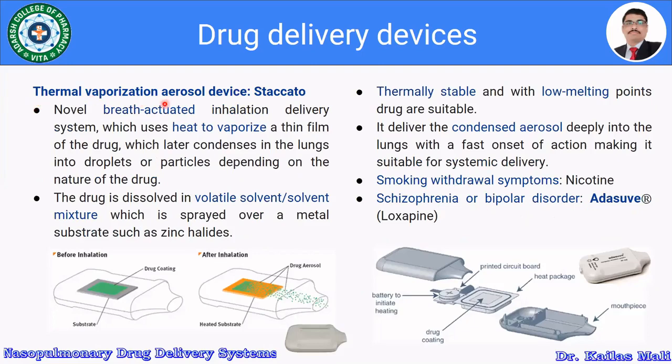Let us see the thermal vaporization aerosol device, that is Staccato. This is the Staccato device, which comprises a plate coated with the drug solution. This is before inhalation, and this plate is going to be heated, which is going to aerosolize the drug, and furthermore it is going to be inhaled, that is after inhalation.